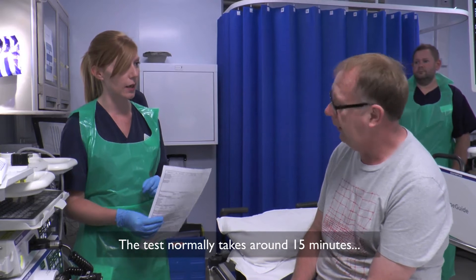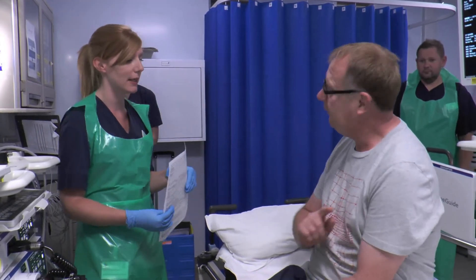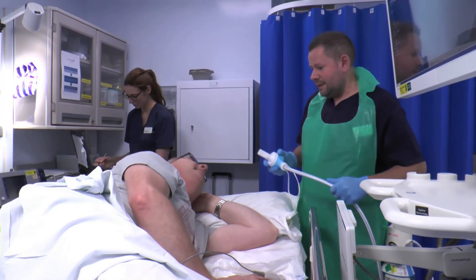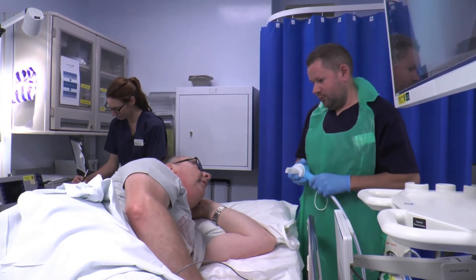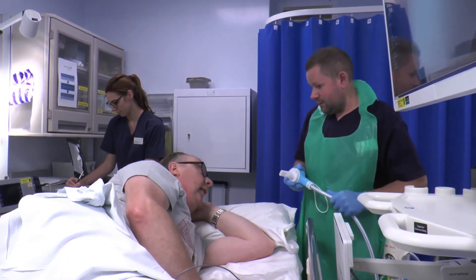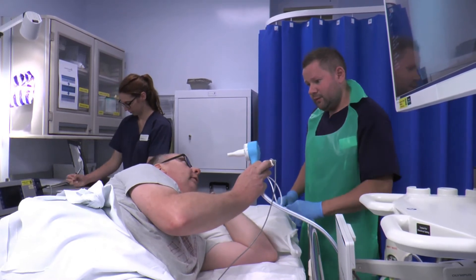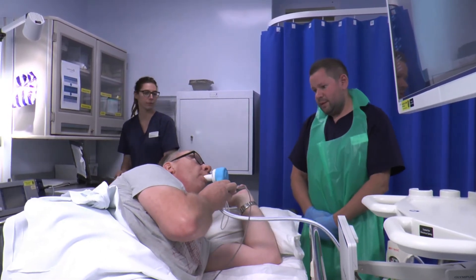The test normally takes around 15 minutes. Gas and air is available if needed. With this test you can have some gas and air, which will help with the discomfort from the air going in from the camera. You can try the gas and air from the start or have some as you go along. Make a good seal around the mouthpiece and take some nice deep breaths in and out.